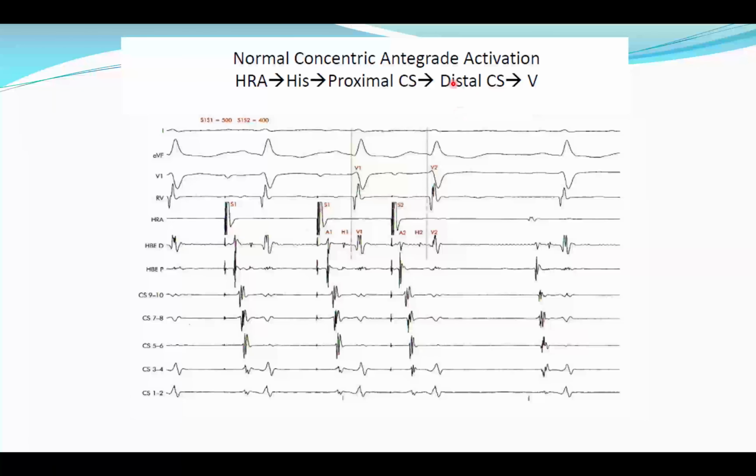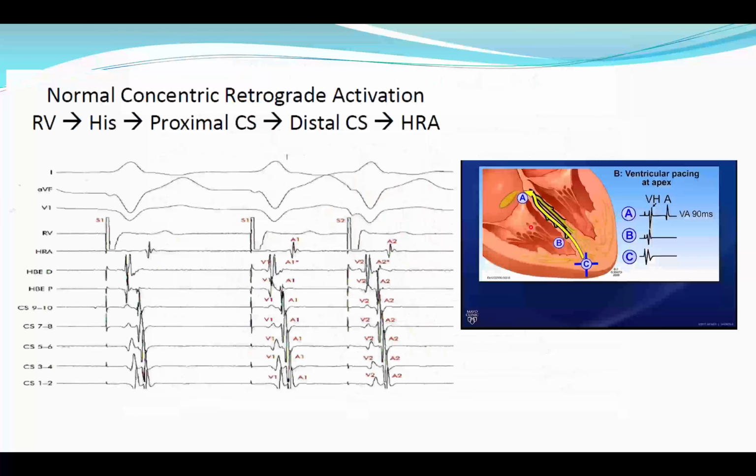And this is an example of how we give atrial extras, because if I stress my AV node, if there is a dual AV node physiology, then I may have an AH jump and induce AVNRT. Or if I stress the AV node, if I delay the conduction through the AV node, even if there is an AVRT, this beat may conduct back and I may induce supraventricular tachycardia. So this is antegrade conduction.